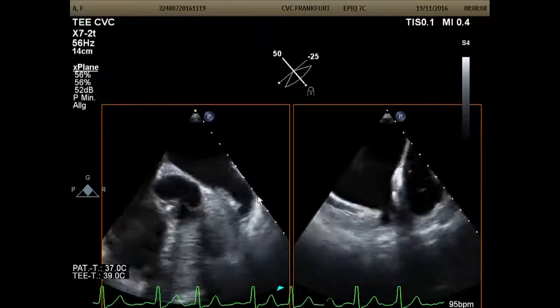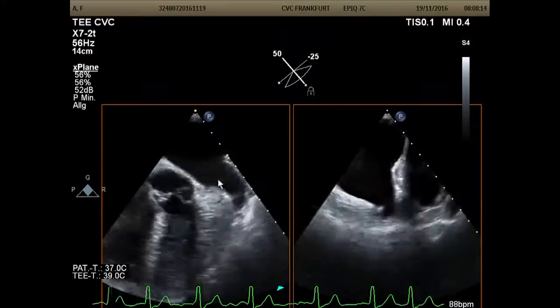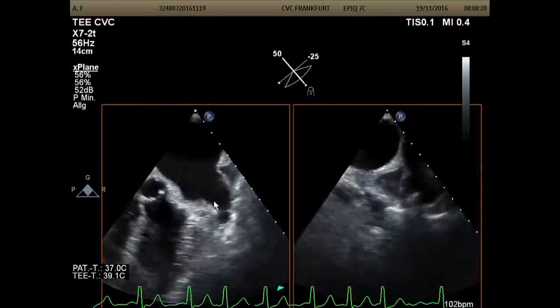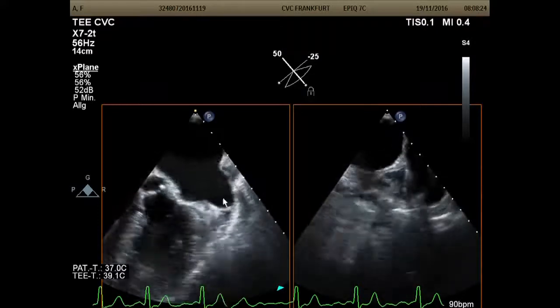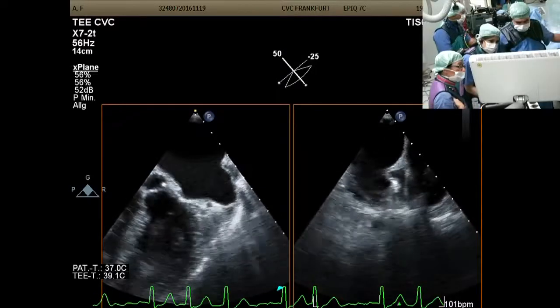Oh, that's it. Okay, so we're just showing you the top of the Warfarin ridge here, or the Coumadin ridge, and you can see here this is the orifice, and the circumflex vessel is here. You can just see glimpses of it coming and going. There it is there, yeah? So you can see actually there isn't much lobe beyond that point. So we'll keep going. We might just do a quick measurement while we're here.